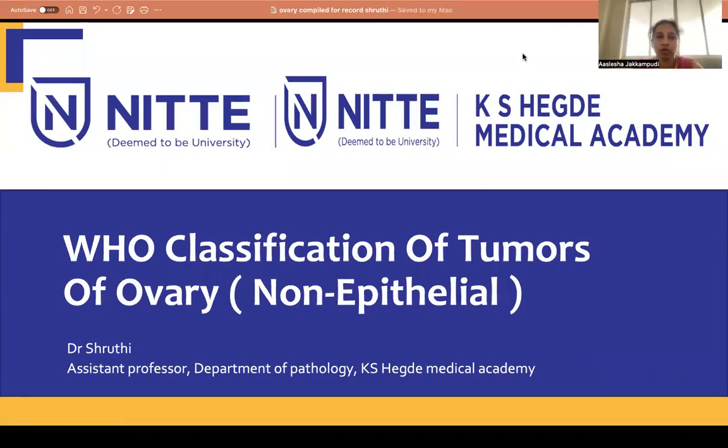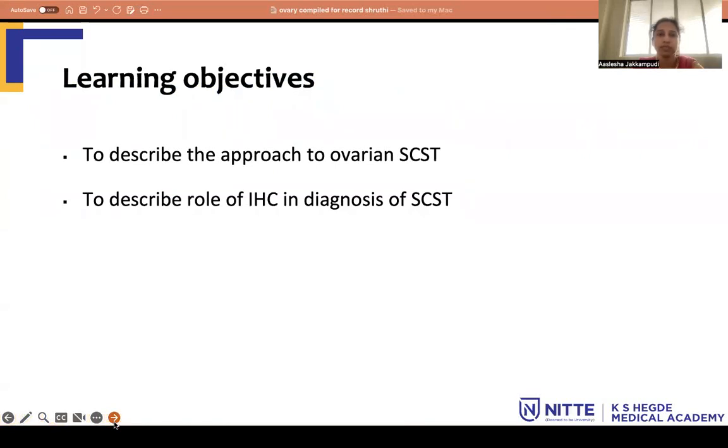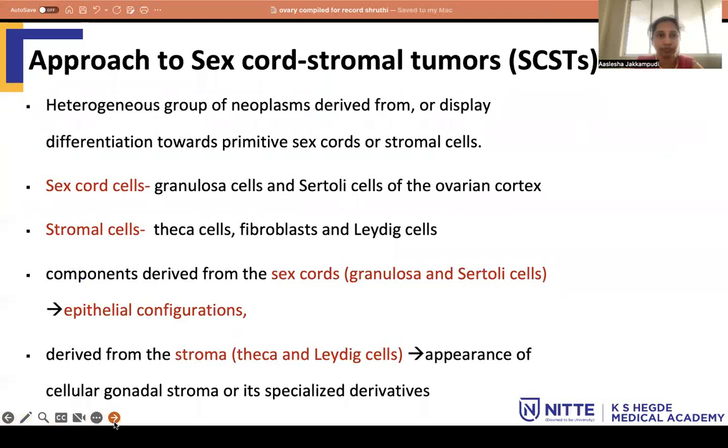Welcome to the e-learning module on WHO classification of non-epithelial tumors of ovary. In this section, I'll be talking about the approach to sex-cord stromal tumors, in short SCSTs. The objectives are to describe the approach to ovarian sex-cord stromal tumors and to know the role of IHC in the diagnosis of these tumors.